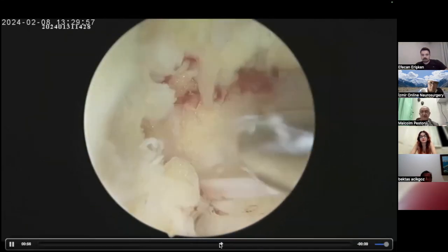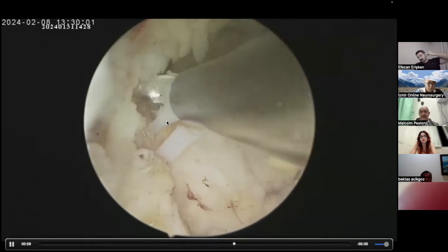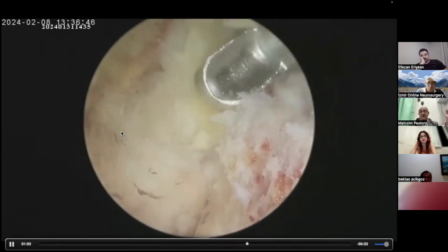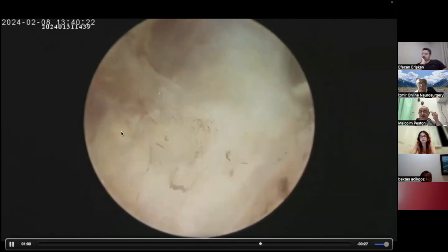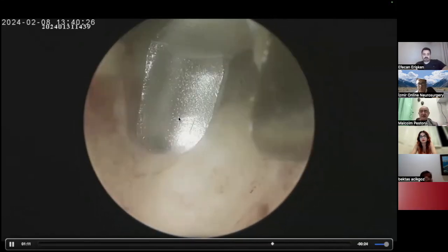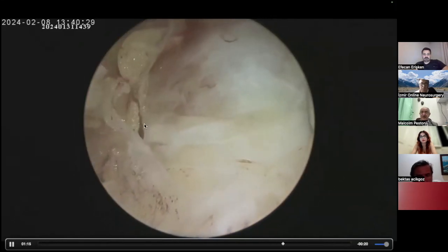So I'll just jump this. And you can see that I've torn this vein here, but you can still see how the root is cranial to that. So despite my tearing that vein, I know that my root is still safe. The whole concept is to know where is your enemy. Can you see these 3 veins? See how they're tethering the root. This is coming from below the axilla.